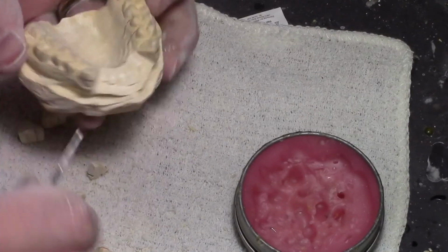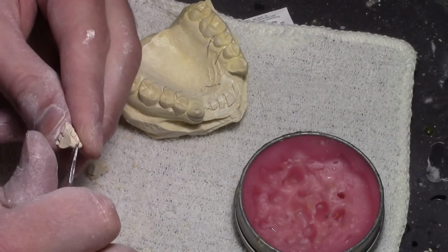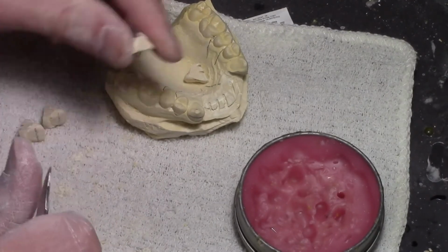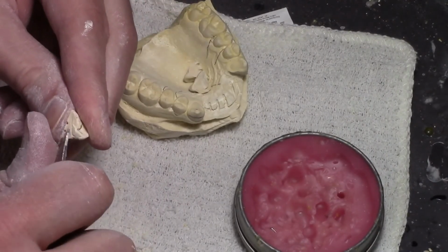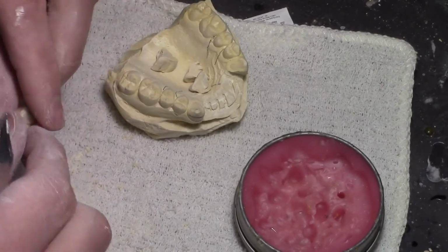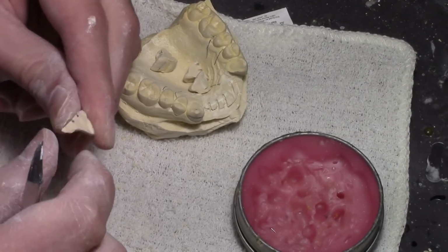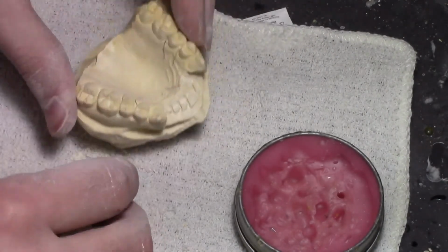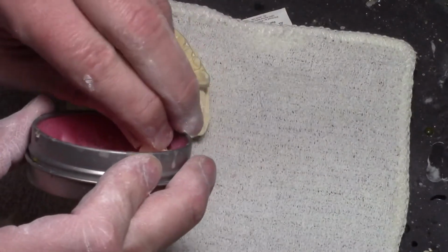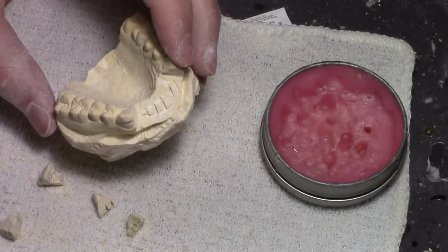Alright, so I'm just smoothing it out again. Just kind of smoothing out that interproximal area where the teeth touch. I'm sure there's a word and I've already forgot it because I'm live on camera and I can't remember words. So I'm just smoothing. I'm not trying to take off any, because the doctor said no stripping. In between the teeth. Sometimes, depending on the stone, you'll get a lot of crumbs. You could stick it in wax like this, and it will help take off those. Usually I'll have a mound of this white wax.